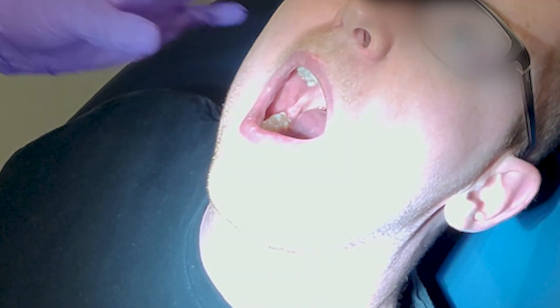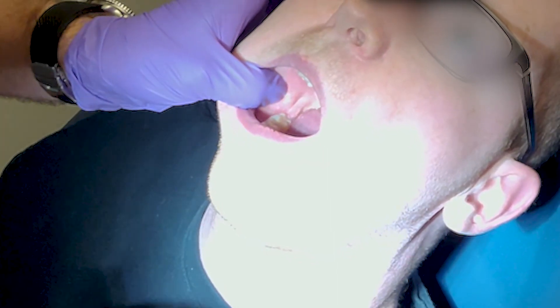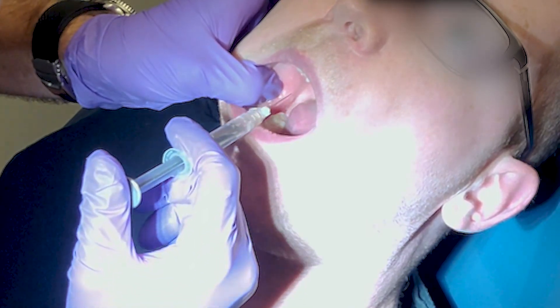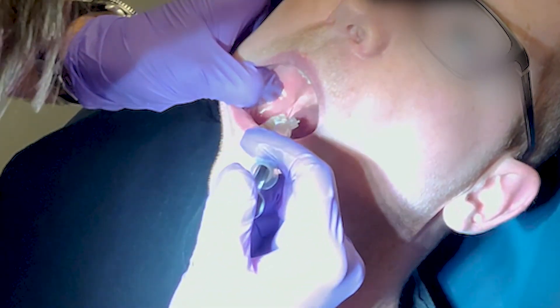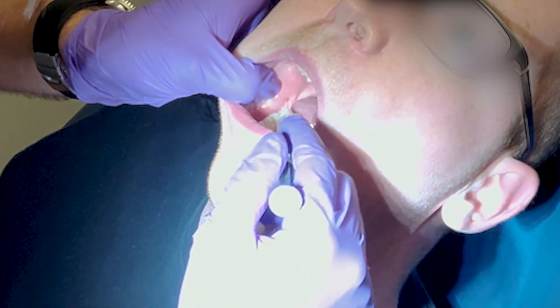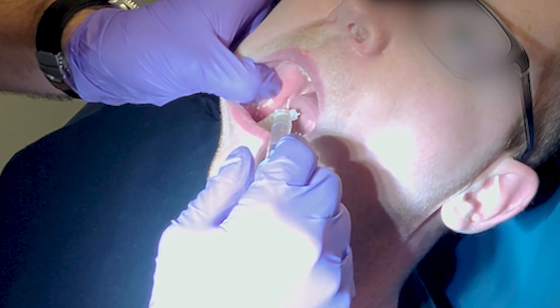In this video, the physician feels the coronoid notch with his thumb. He is able to visualize the pterygomandibular raphe and can select the injection site. He introduces the needle, making contact with the mandible. He withdraws and aspirates. He injects the anesthetic.